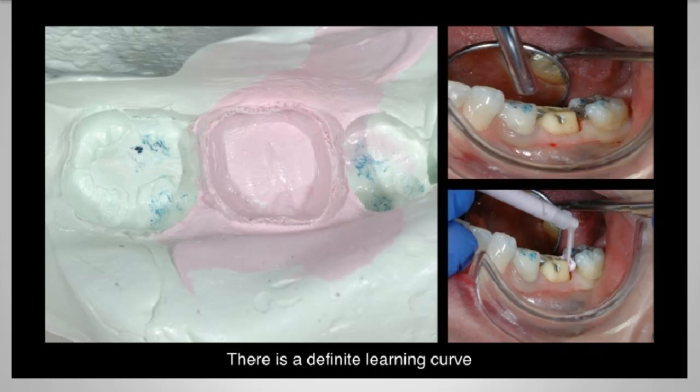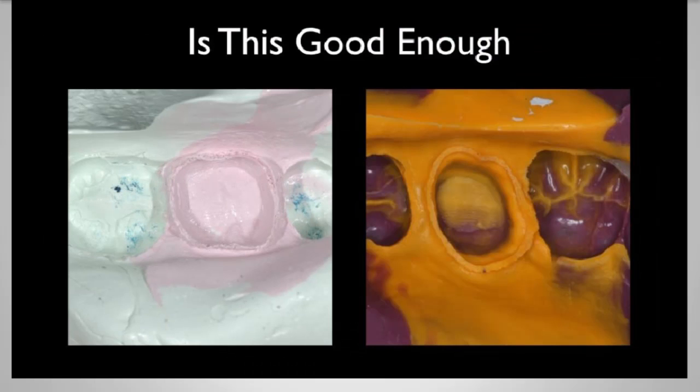And when we look at these impressions, we have to be critical. And we have to say, are we capturing the right amount of detail? Is there enough that's there? So I used Aquasil impression material for years. When I used it, I had very, very nice, highly defined impressions. When I saw some initial advertisements come out and I saw these pictures, I wasn't quite sure. And upon looking at those photos, I said, you know what, in my opinion, it's not quite good enough. But I need to try it in my own hands, because is it a technique issue? Is it a learning curve issue, or is it a product issue?